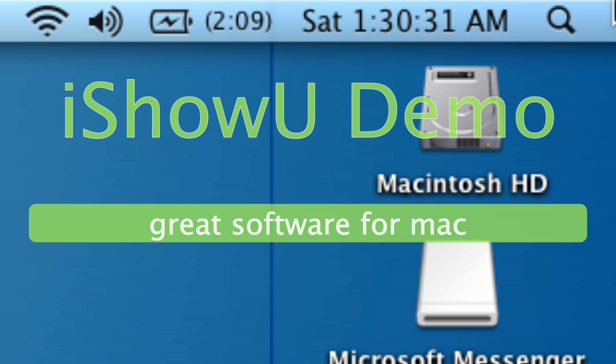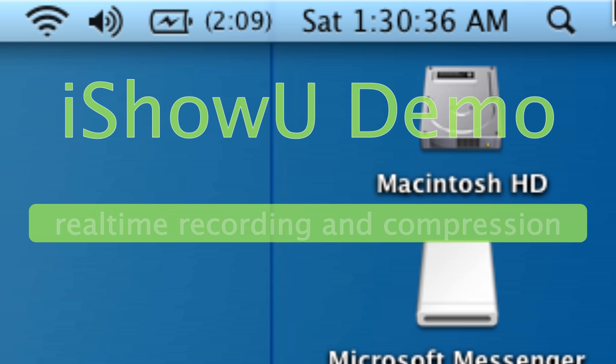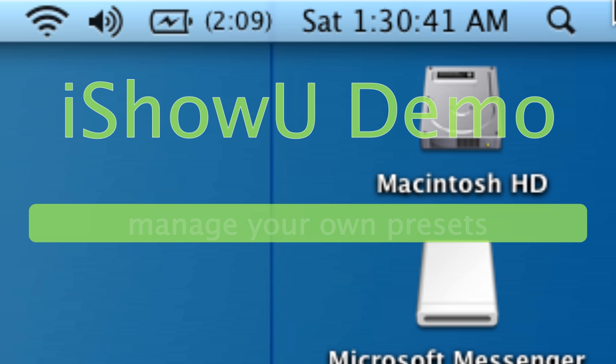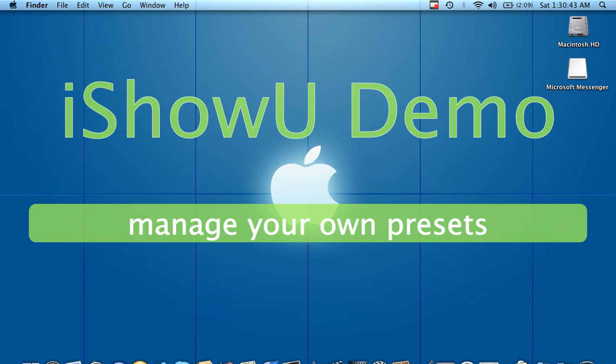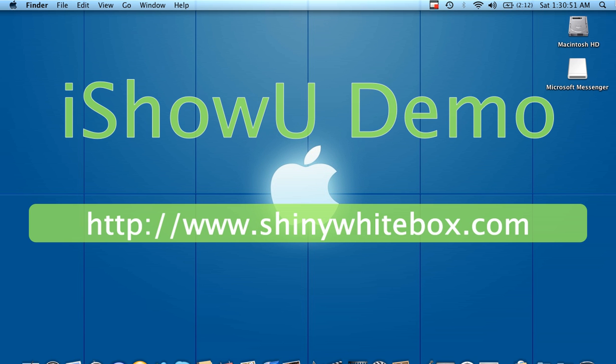Running VoiceOver, the magnifier, and iShowU, which is what I'm using for the demonstration version, hence the text on the screen. Running all three of those at once can put a toll on the system, so I don't want to do that. So we'll get out of here, and you push Function Command F5 to start the VoiceOver utility.